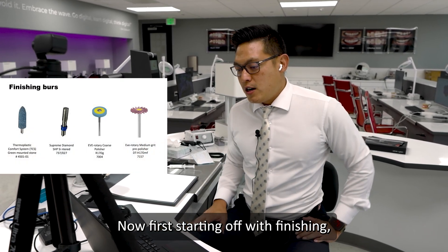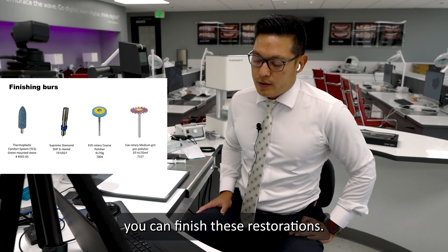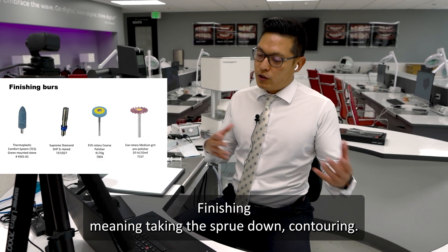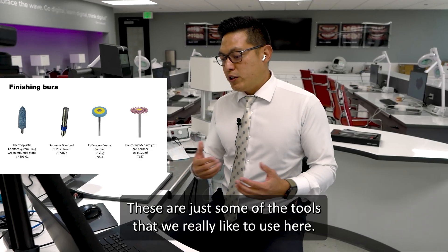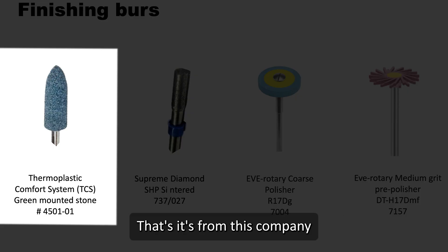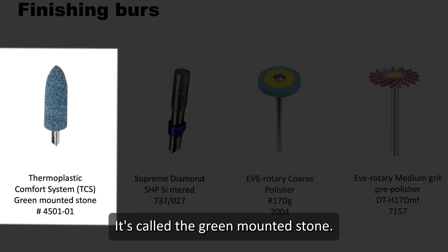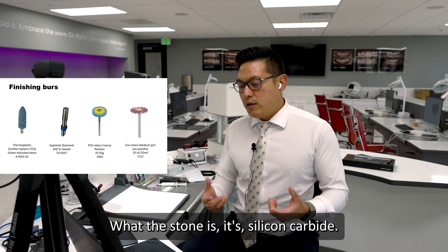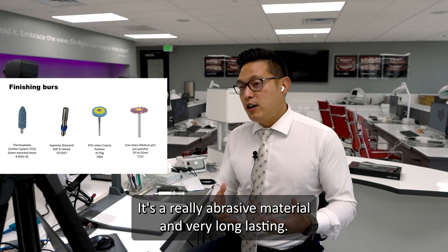Starting off with finishing — finishing meaning taking the sprue down, contouring — these are some of the tools that we really like to use here. The one I use most often is on the left-hand side. It's from TCS, Thermoplastic Comfort System. It's a green mounted stone — a silicon carbide — which is a really abrasive material and very long lasting.